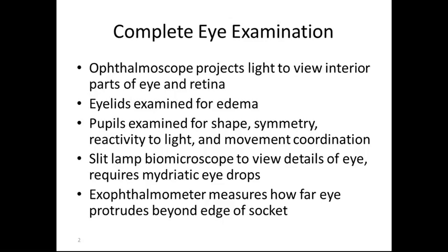A slit lamp biomicroscope is used to detail the eye and requires mydriatic eye drops. Mydriatic eye drops dilate the pupils for this examination. An exophthalmometer measures how far the eye protrudes beyond the edge of the socket.